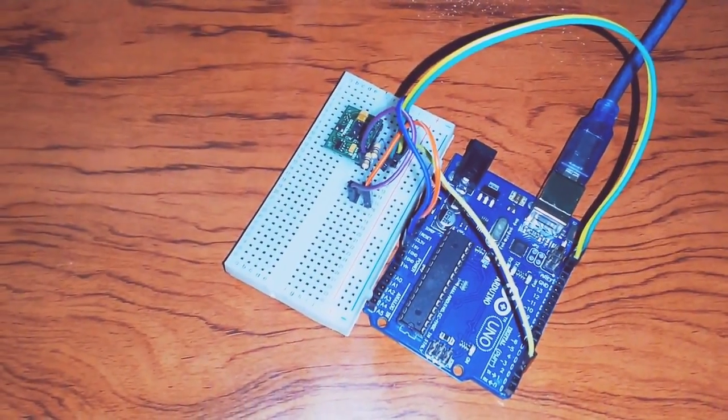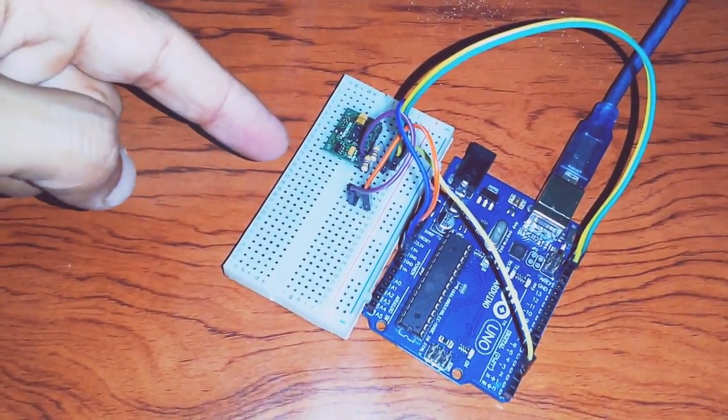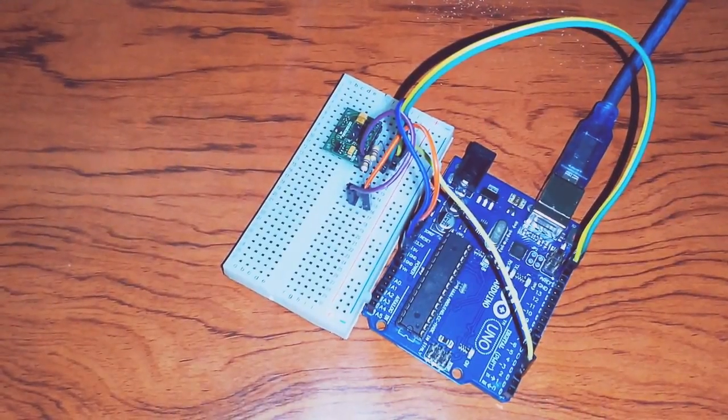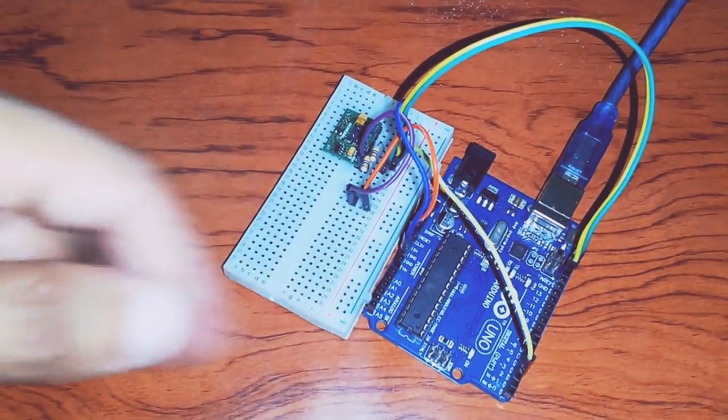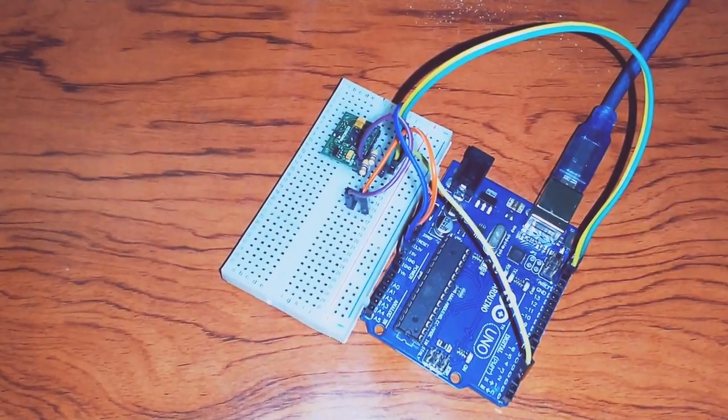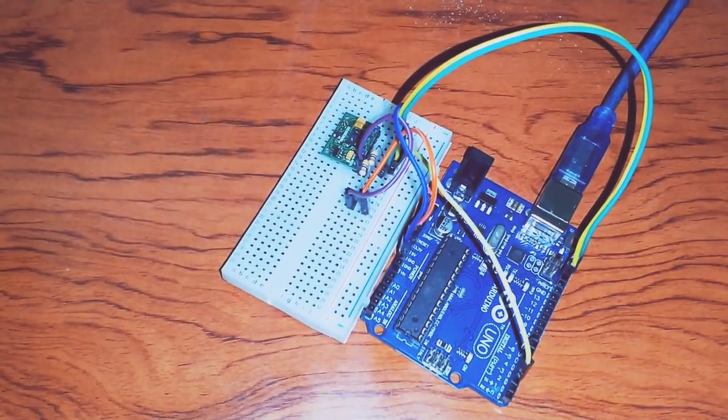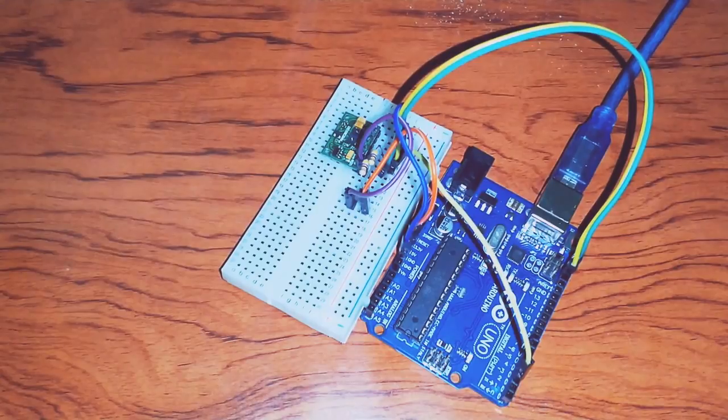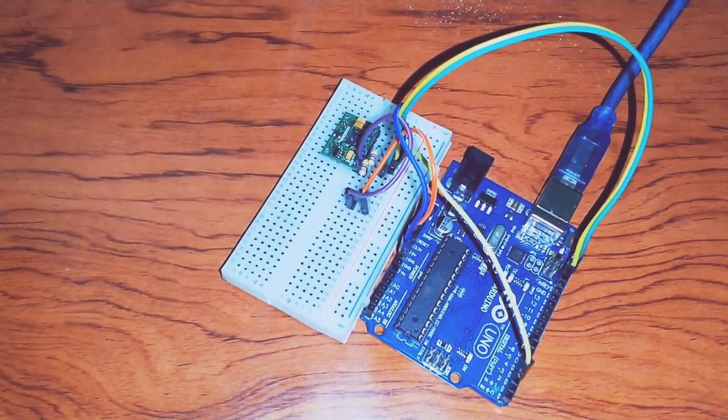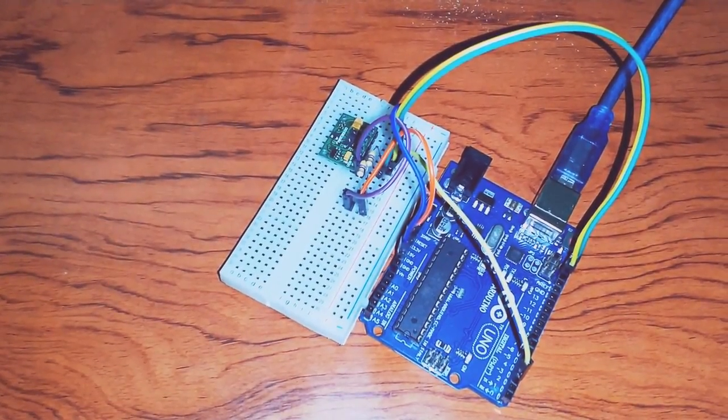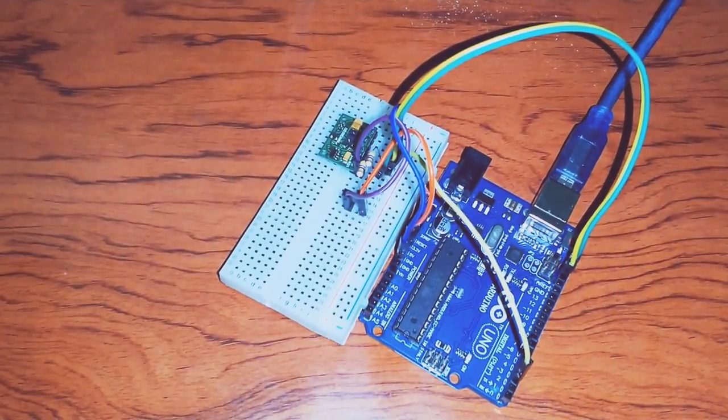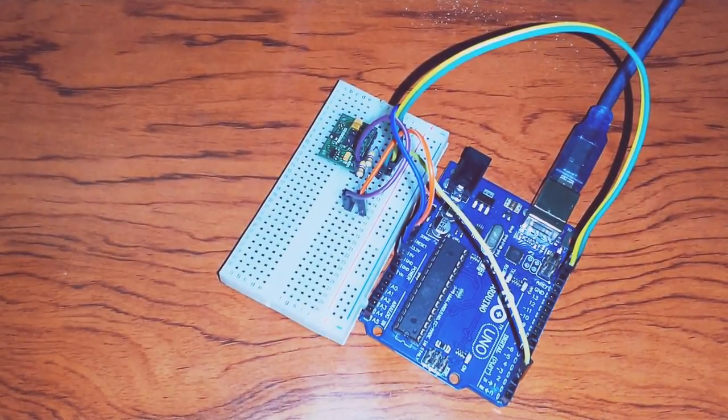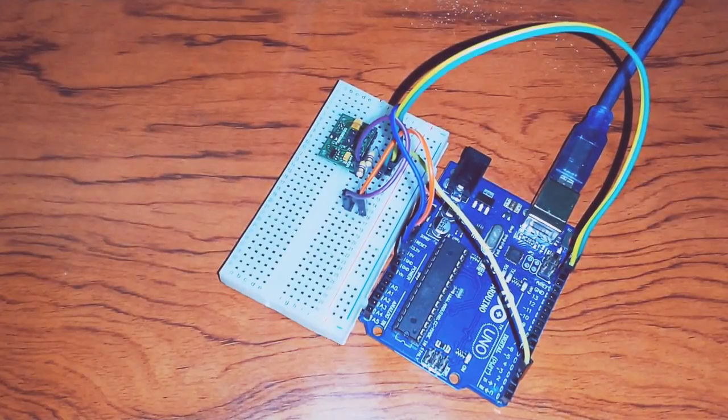Hello guys, this is the MAX30100 sensor, which is a heart rate and oximeter sensor connected to Arduino Uno. I've searched a lot about how to wire this sensor with the Arduino and how to properly program it, and I was not successful until today. I found a way to do it and wanted to share with you guys so you might want to try it.